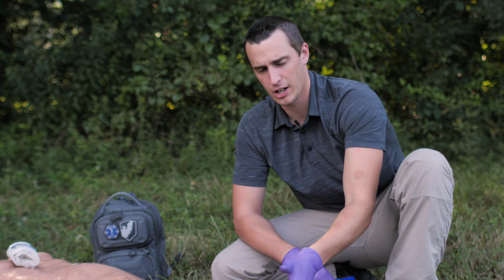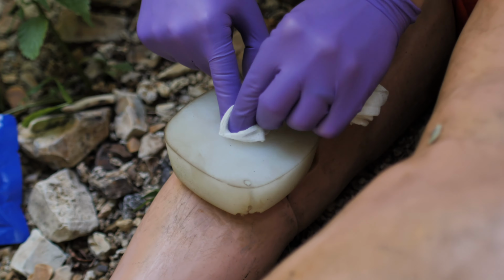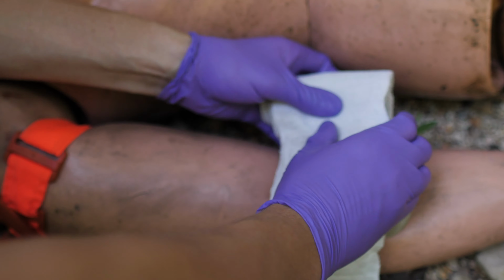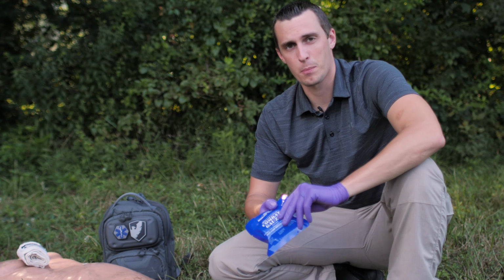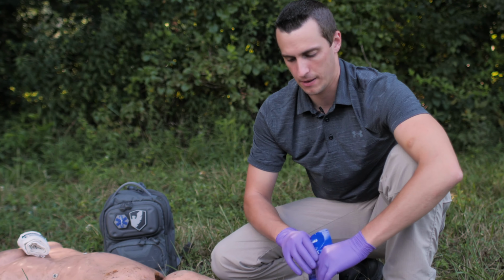That we have an isolated gunshot wound or penetrating trauma just below the knee. Okay, now that we're talking about our tourniquet conversion, we're working on converting this over. We're gonna pack it with some QuikClot and we're converting it over to wound packing rather than the tourniquet.